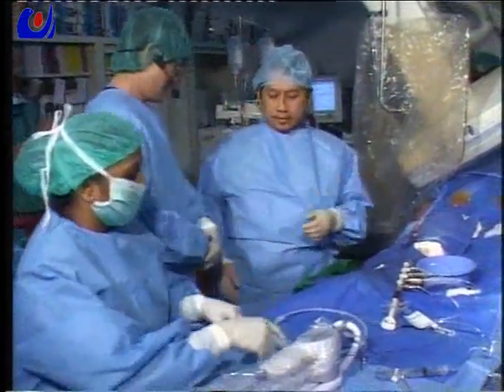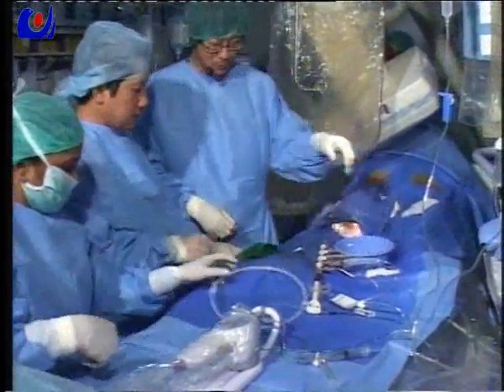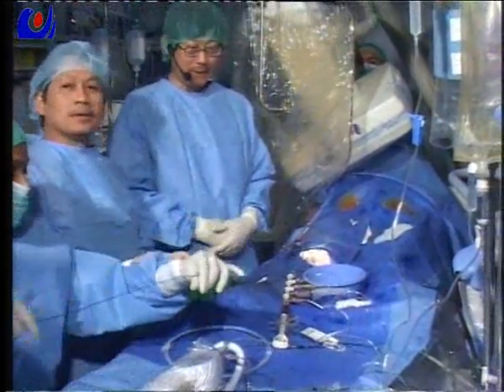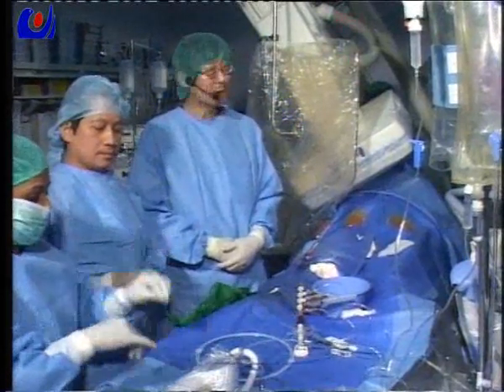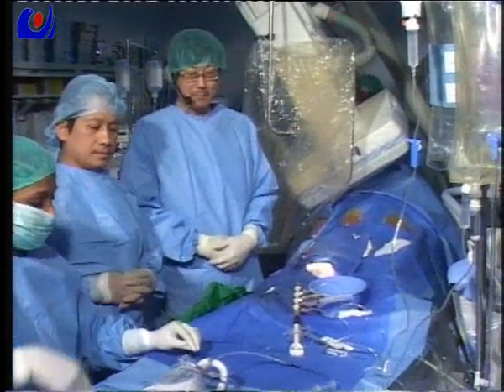All right. So before we do the left main and LAD ostium and multiple stent lesions in the LAD, we do have a diagnostic shot by Dr. Hisham showing that the RCA in the proximal and mid portion also has two borderline lesions.